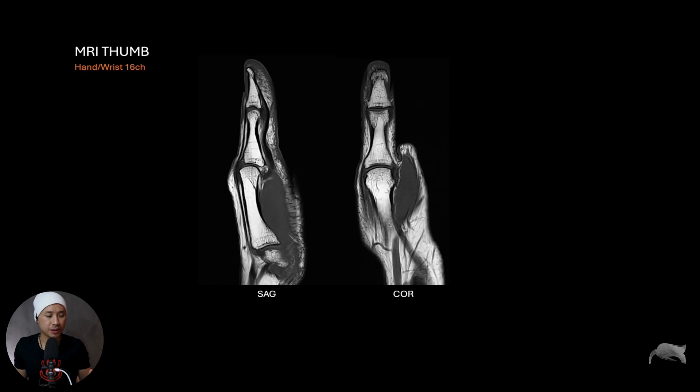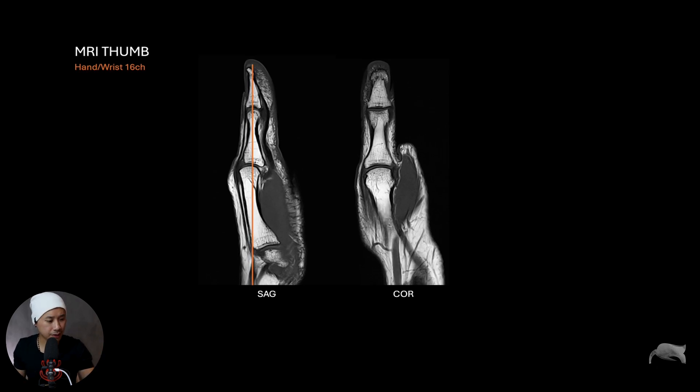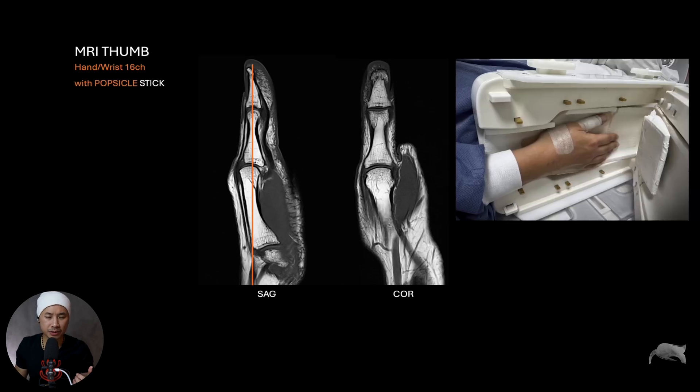So you can see it's very difficult because I really want to have one straight line. This is the method I was talking about — the very cheap method. It's very easy now to get a straight line, a direct coronal, a very straight line on the thumb. What we did here was use a popsicle stick — just a stick like this one.